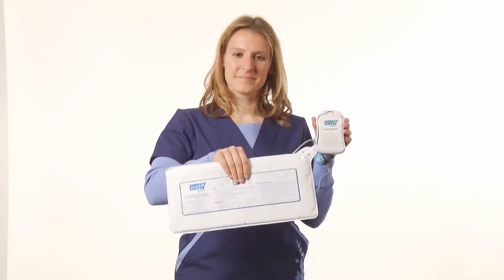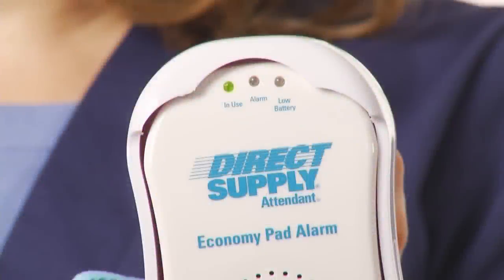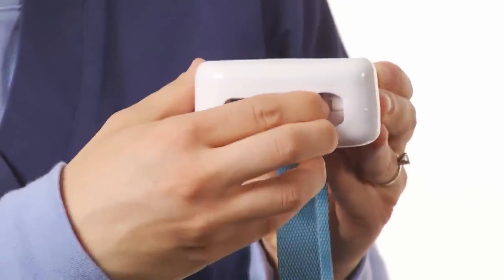Test the alarm functionality by pinching and releasing pressure from the pad. An in-use light at the top of the alarm will indicate the alarm is active. The alarm light will be activated when pressure has been released from the pad and the alarm will sound. The low battery light will blink and chirp when the battery needs to be replaced. Reset the alarm by simply reapplying pressure to the pad or by turning the alarm off and then back on.